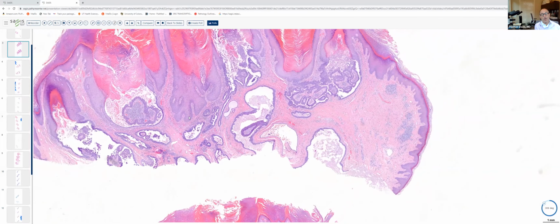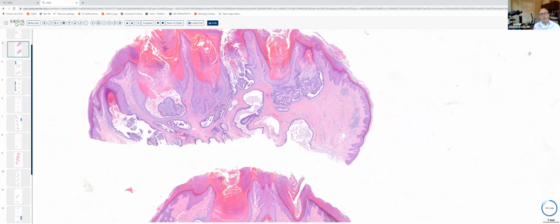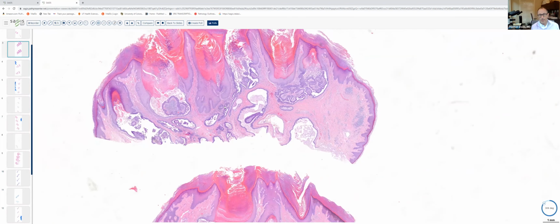Again, the histologic differential here would largely include this tumor, a hidradenoma papilliferum, which also has papillary projections extending into cystic spaces, and possibly even a digital papillary adenocarcinoma. All three tumors are characterized by epithelial-lined glandular structures with papillary projections. Syringocystadenoma papilliferum again shows attachment to the overlying epidermis. It's characterized by papillary fronds that have a plasma cell-rich infiltrate. The other two tumors are not.